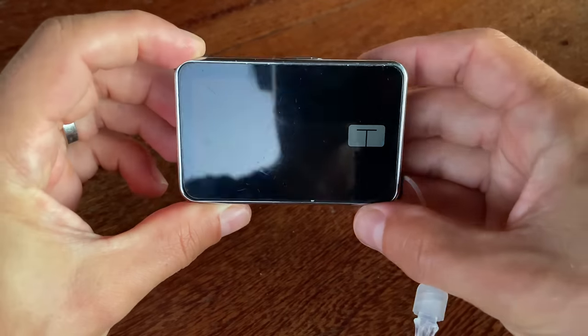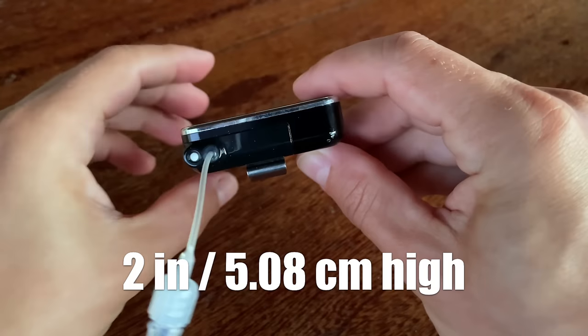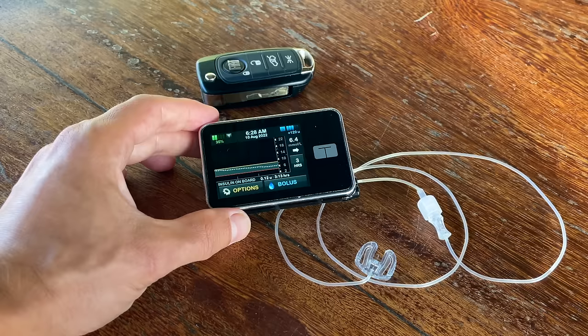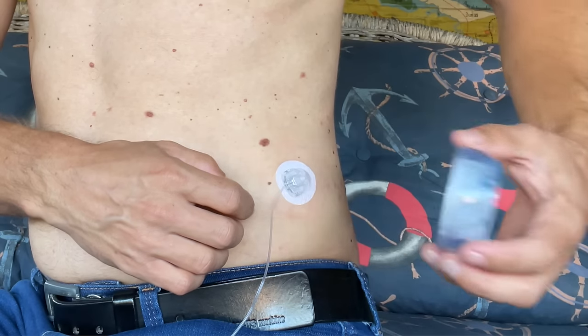The T-Slim X2 weighs about 4 ounces or 113 grams. It's about 3 inches long, 2 inches high, and 0.6 inches deep. It's a tube pump, so it uses a disposable plastic cartridge and insulin is delivered through an infusion set and a cannula placed under your skin.